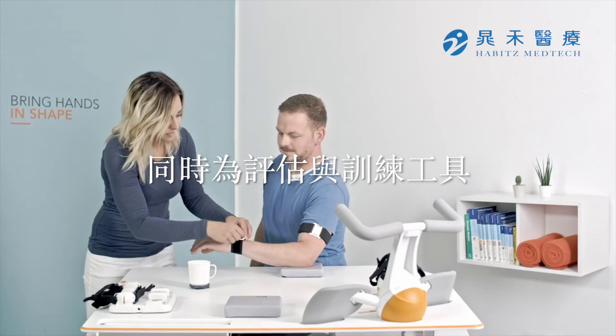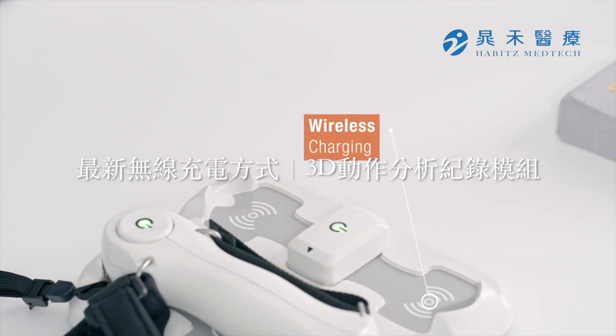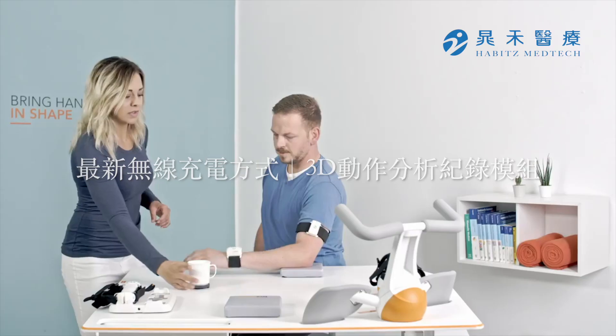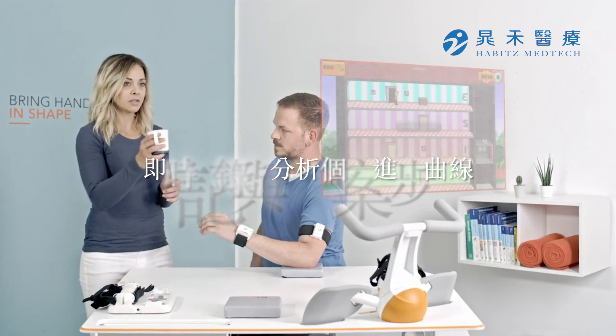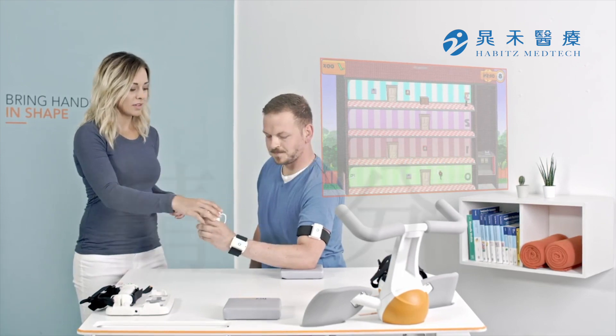Movement of the patient's arms is measured using inertial measurement units. Pablo utilizes wireless charging and transmits data between its 3D motion sensors and a computer via Bluetooth, giving therapists access to detailed information regarding the patient's progress.